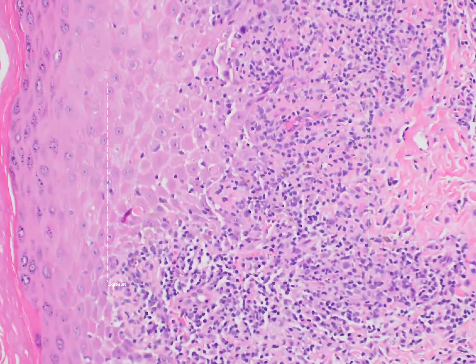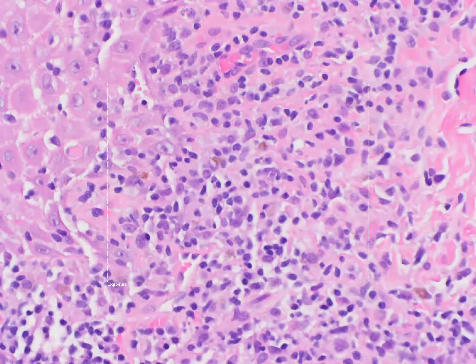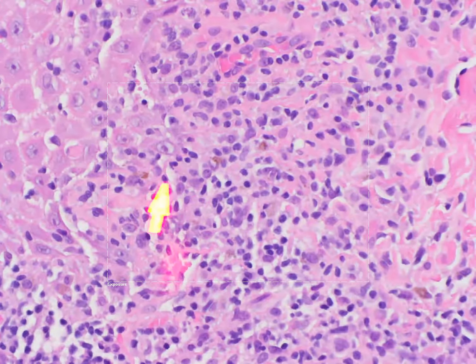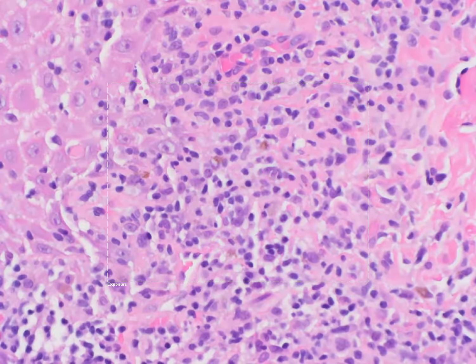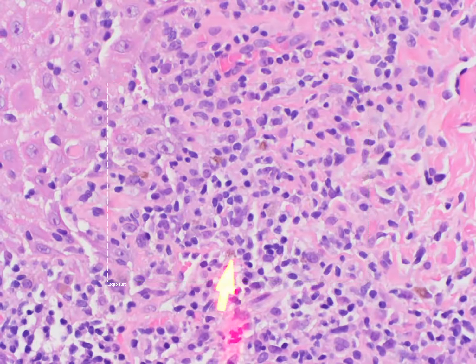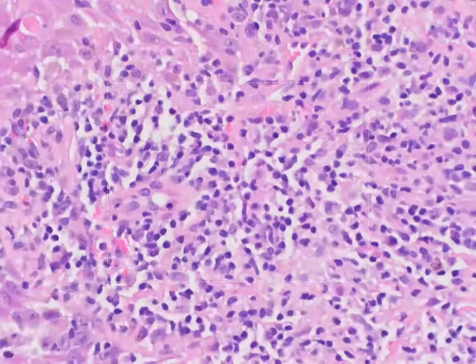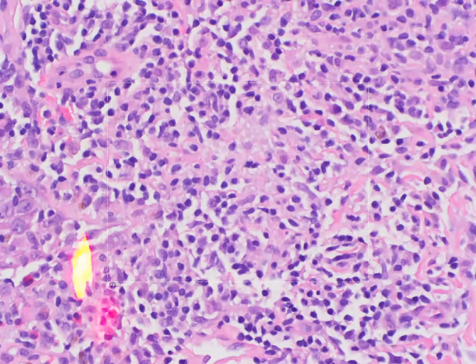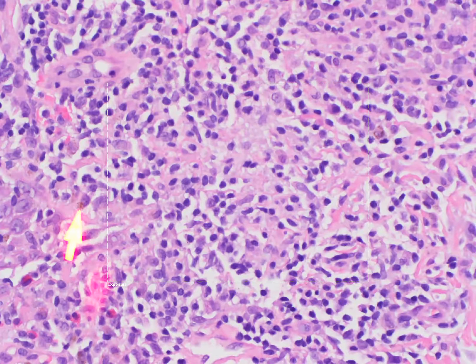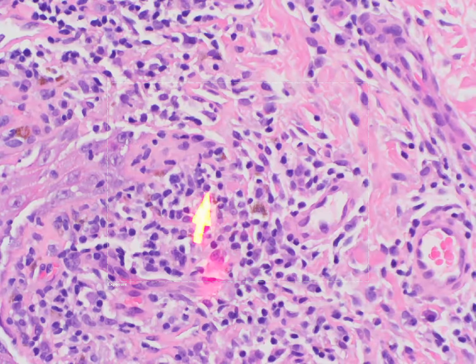Okay, so that's another feature of interface. And then one last thing I want to point out is the melanin incontinence. So there are macrophages in the superficial dermis that engulf melanin pigment that gets released from the overlying epidermis as a result of this interface insult and engulf those melanin granules. And so you can see melanophages in the papillary dermis, and we call that melanin incontinence, another feature of that interface pattern.